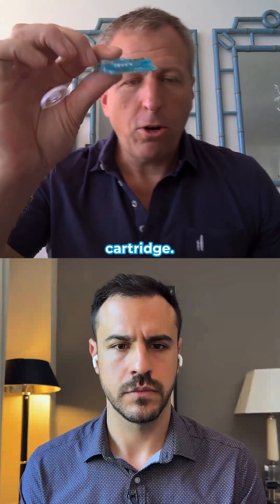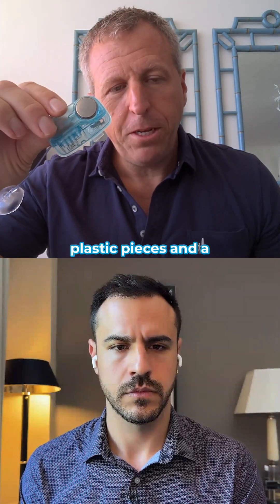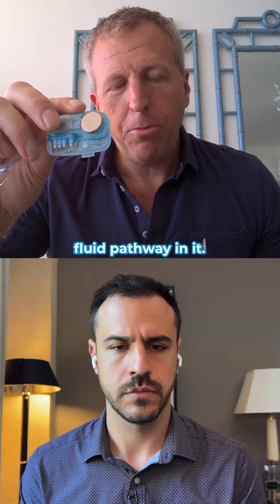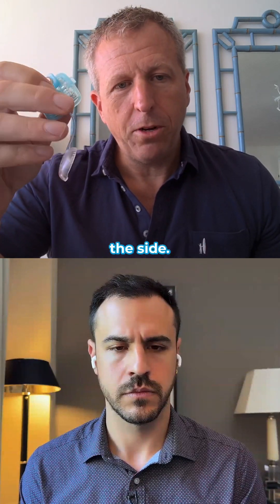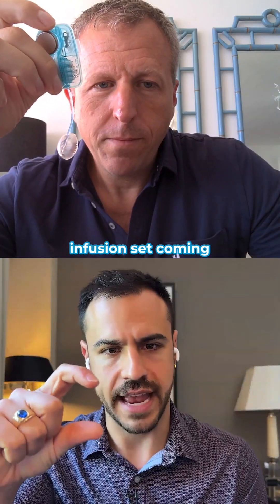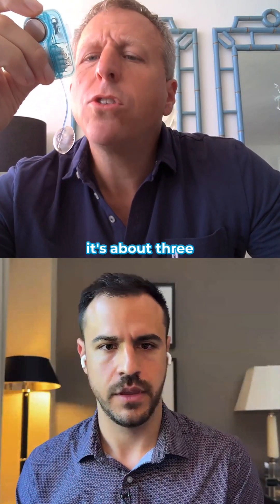This is the cartridge — 12 molded plastic pieces and a coin cell battery. This has the whole fluid pathway in it, and it has a Ypsomed Orbit infusion set coming off the side. The infusion set is about three inches long.